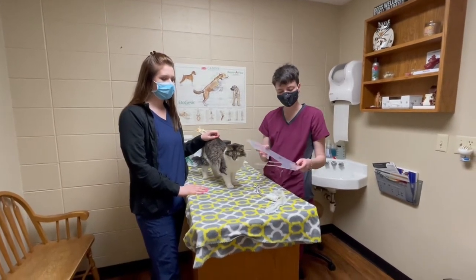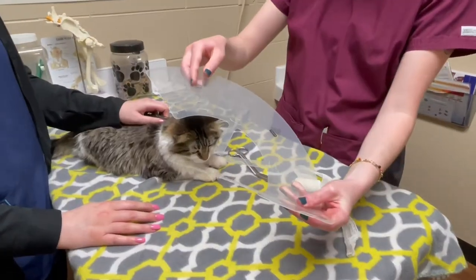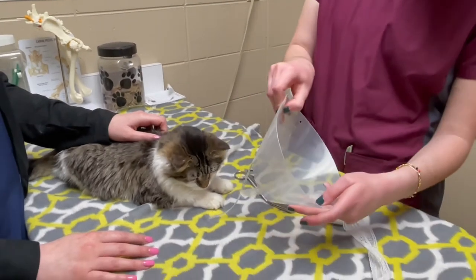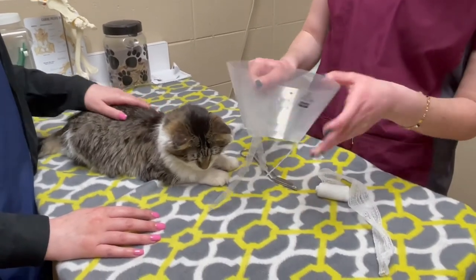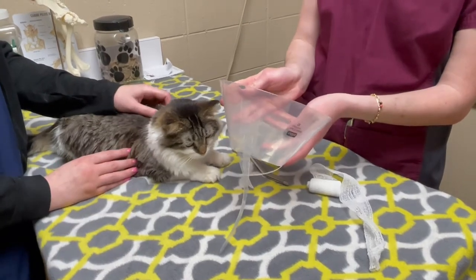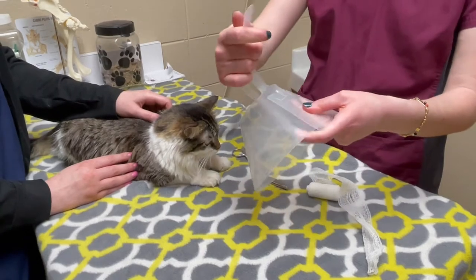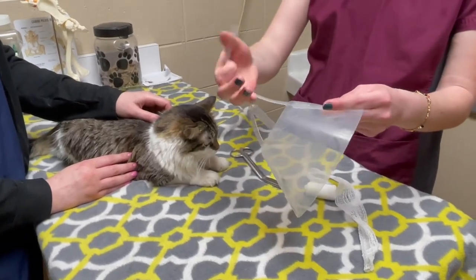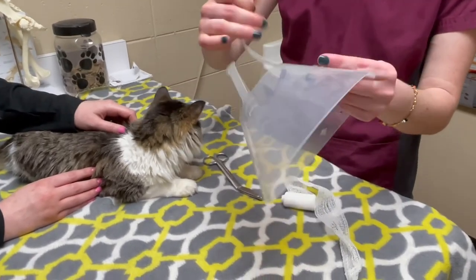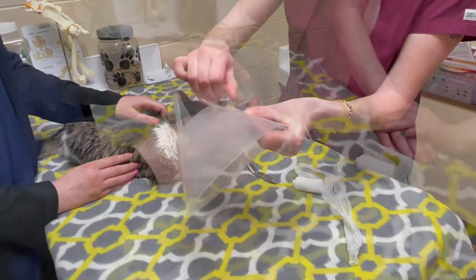This one should fit very well on Junior. To put that together, there are two spots here for two separate sizes, and you just want to compare it to the size of your pet's head and neck. It looks like for Junior this size is going to fit better, so you'll take the cone and first you want to go backwards — and there are little tiny rivets here.